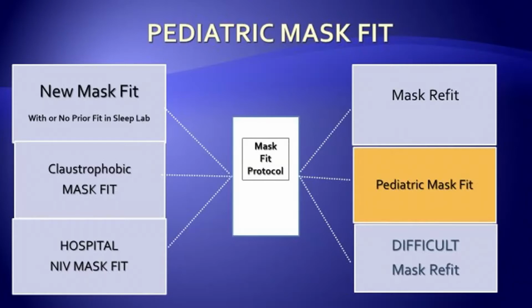Usually the mother will wear the mask, then the child will put the mask on the mother's face, and then through the games, the mother will place the mask on the child's face, and the child becomes accepting of that. But this, again, is a different type of strategy than simply going through instruction.